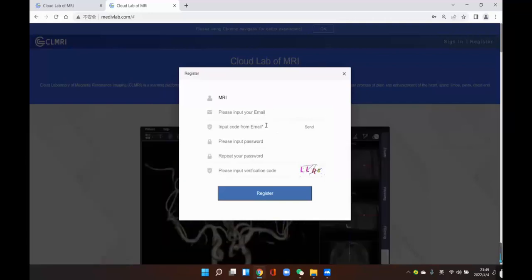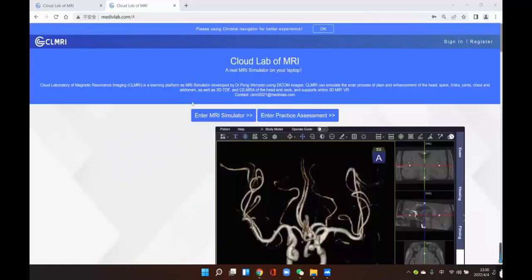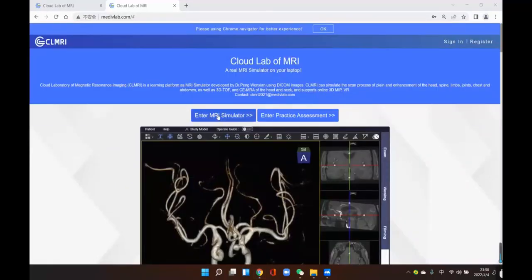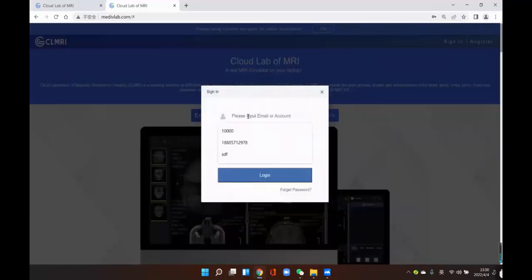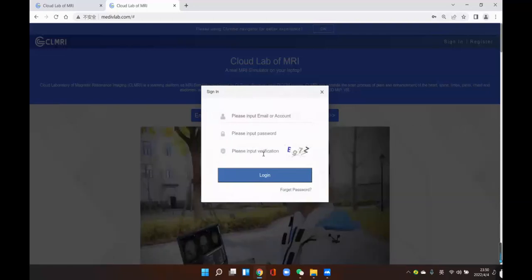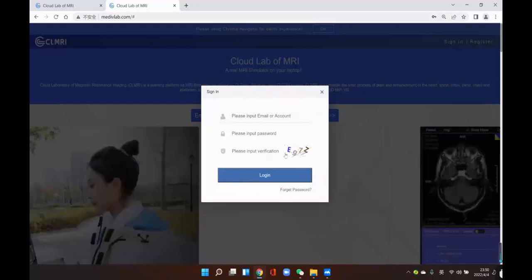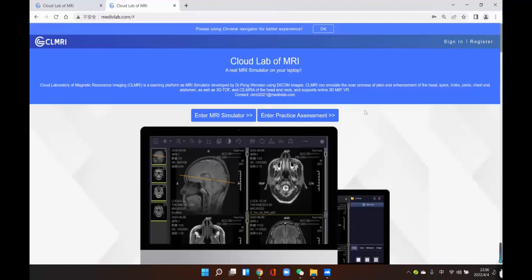You should remember the user ID to sign in. After you register, you can click the 'Enter My Simulator' button. Input your user ID or email address, then input your password and the verification code from the right canvas. Input the letters or numbers, then log in.